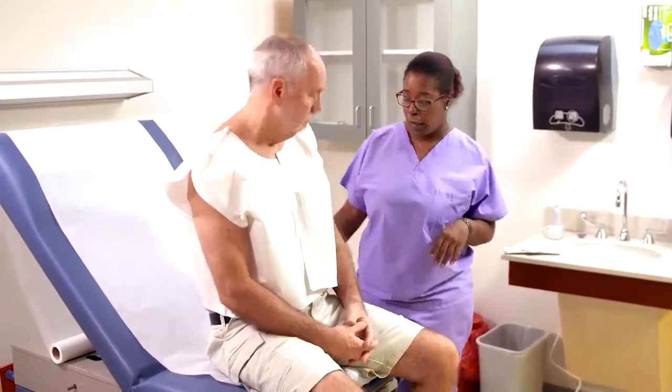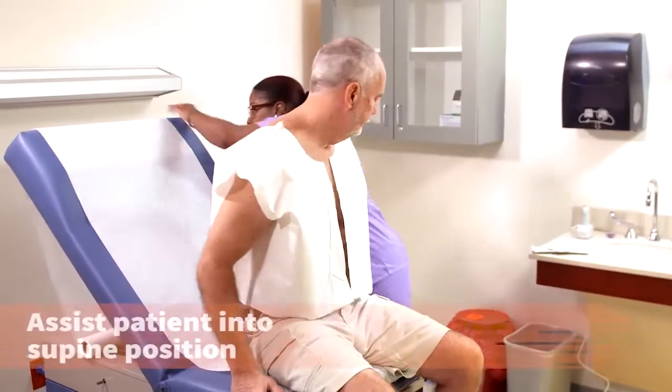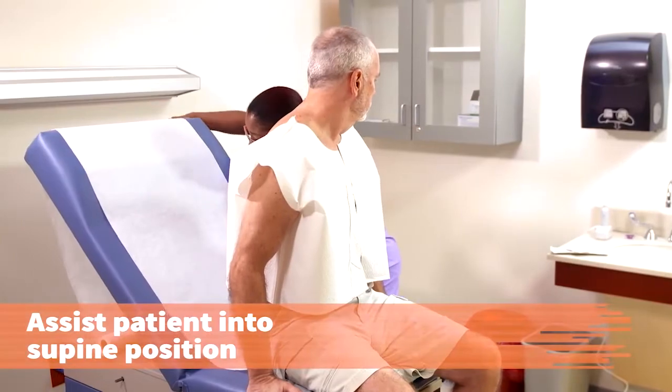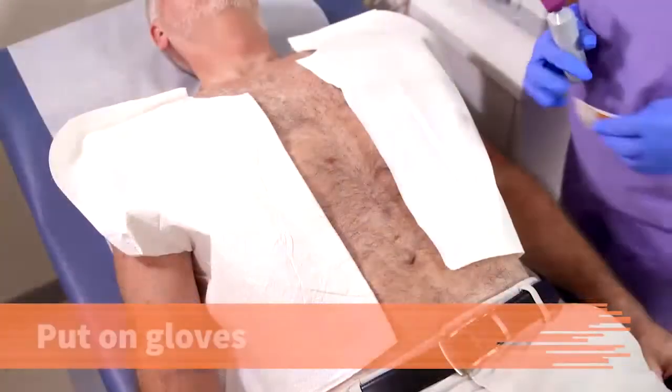Alright, Rick, I'm going to go ahead and have you lay down. I'm going to place the table down first. Assist the patient into a comfortable supine position on the exam table. Provide support for his legs and arms.